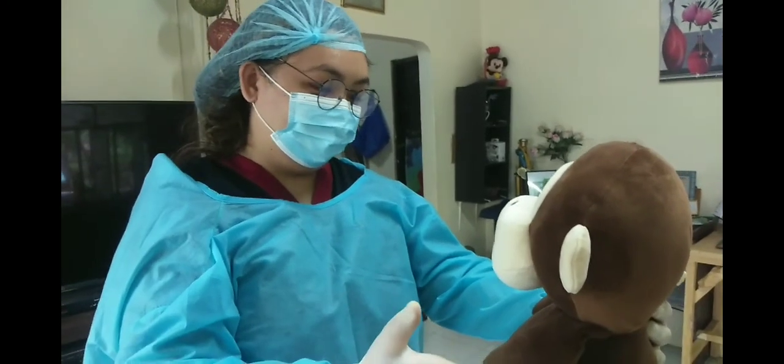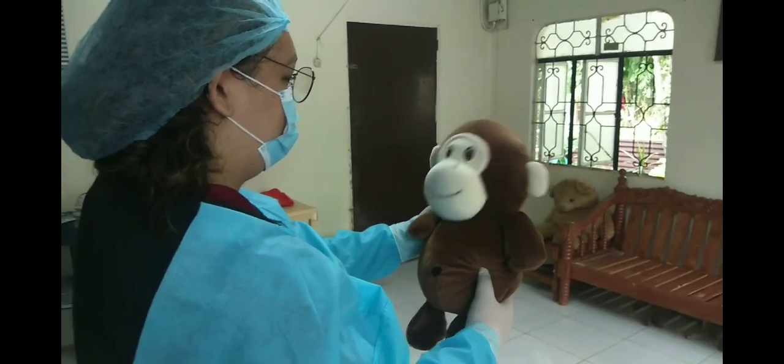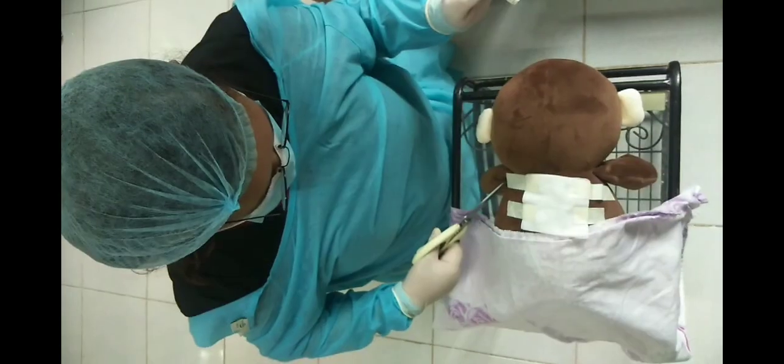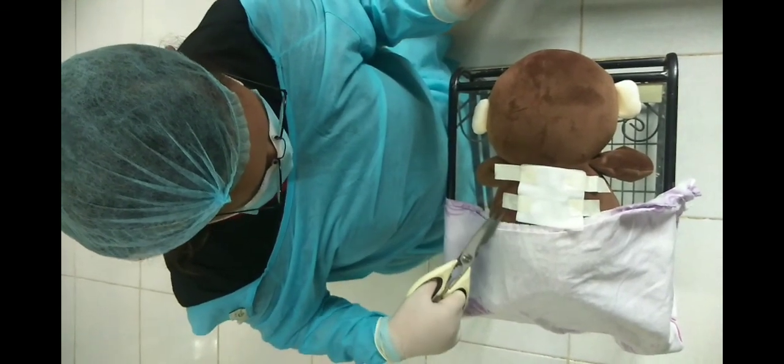Second, explain the procedure to the patient and place him or her in a comfortable position. Keep all of the body covered except the area where the dressing is in place.